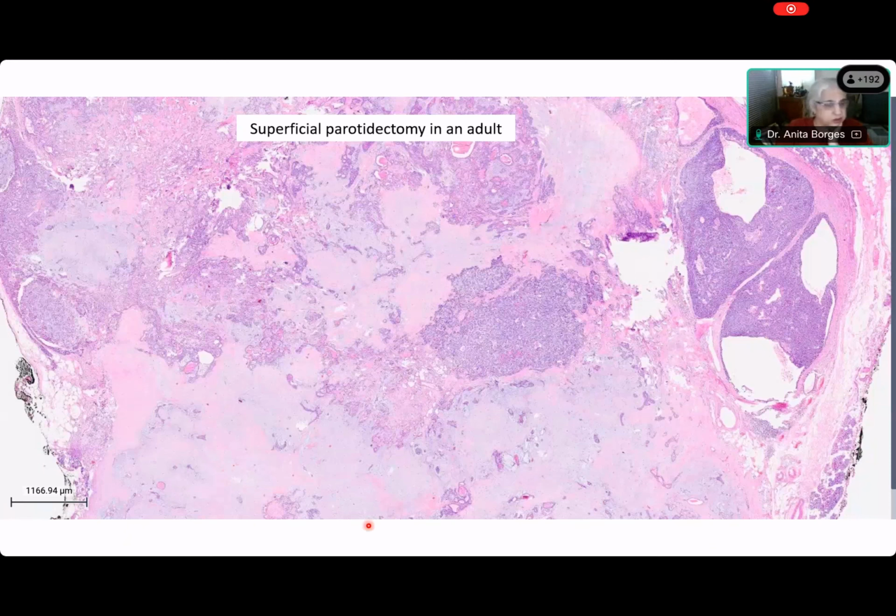Ma'am, there is chondromyxoid stroma. Fantastic. Yes, there's a chondromyxoid stroma. That's the thing that just hits you straight in the face. Excellent, Madhu. Now, what is this variegated appearance that Shivani was talking about? Ma'am, there's different appearance of different areas. Yes, I understand that, but what are those appearances?